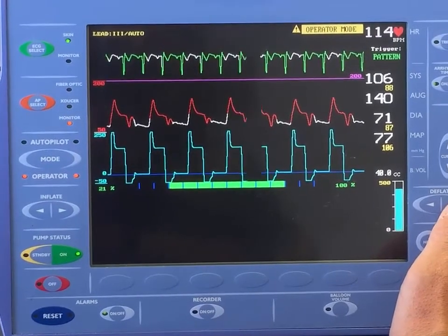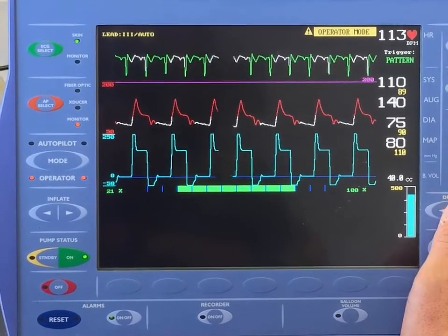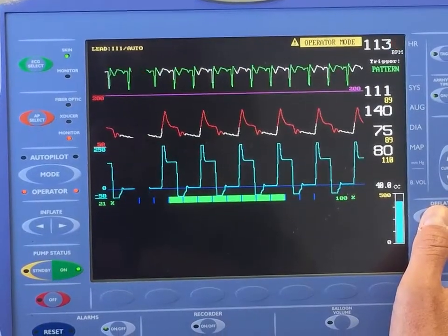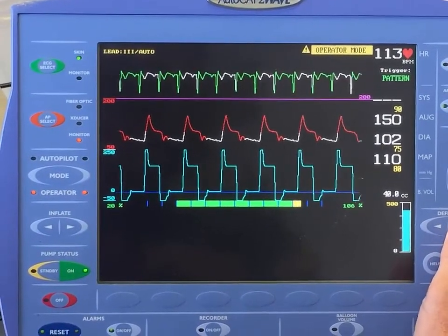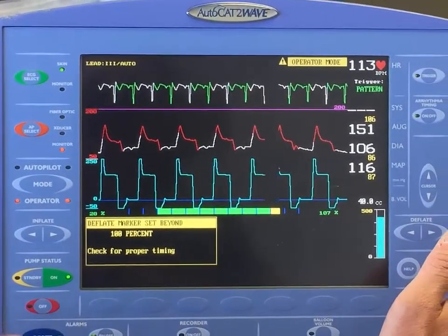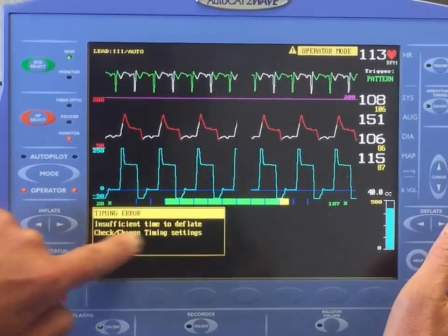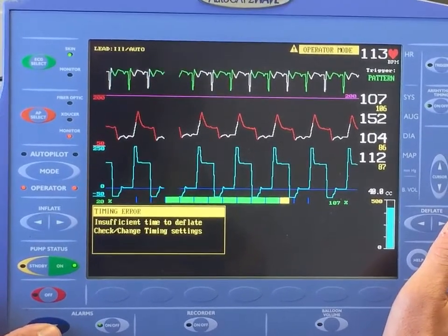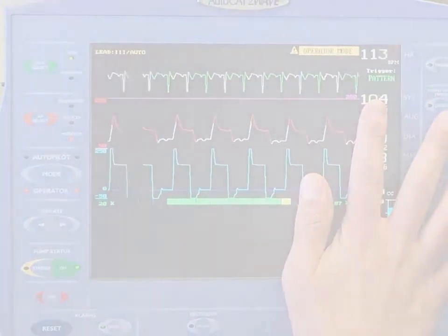With incorrect timing, augmented pressure will appear higher while systolic pressure drops considerably. The pump will set an alarm when the inflation or deflation marker is set beyond the safety level. Reset the alarm as needed — an 'insufficient time to deflate' warning may appear. To summarize: early inflation and late deflation are the critical timing errors to avoid.